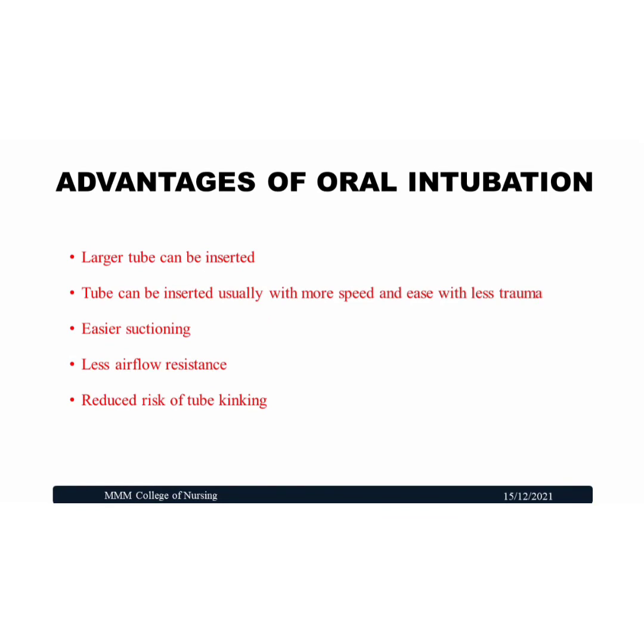Advantages of oral intubation: a larger tube can be inserted through the mouth. The tube can usually be inserted easily with less trauma, suctioning through the mouth is easier, there is less airflow resistance, and a reduced risk of tube kinking when doing oral endotracheal intubation.